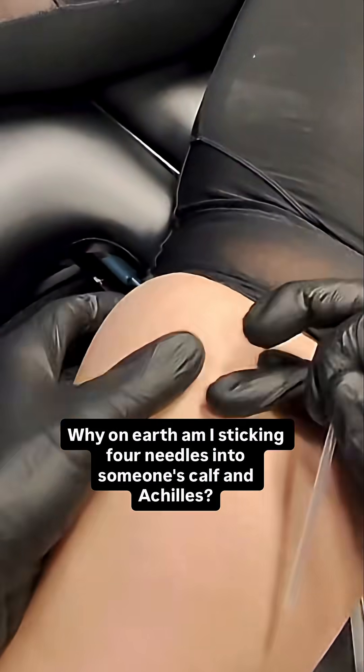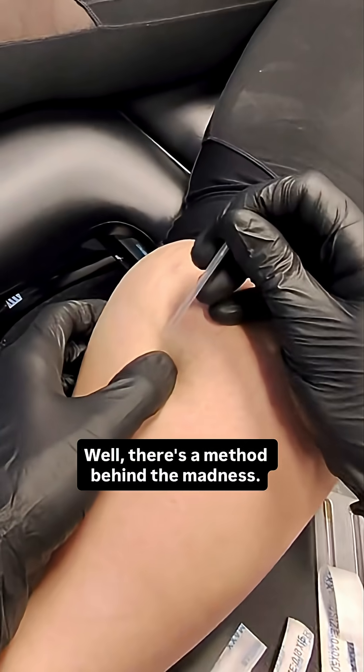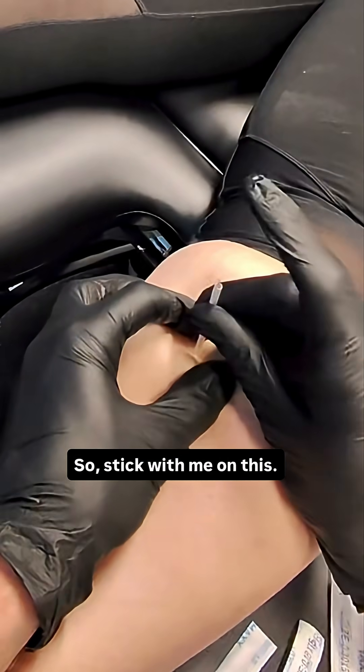Why on earth am I sticking four needles into someone's calf and Achilles? There's a method behind the madness, so stick with me on this.